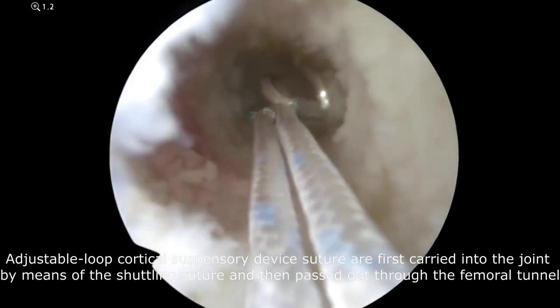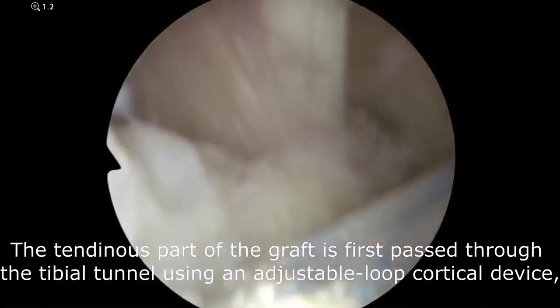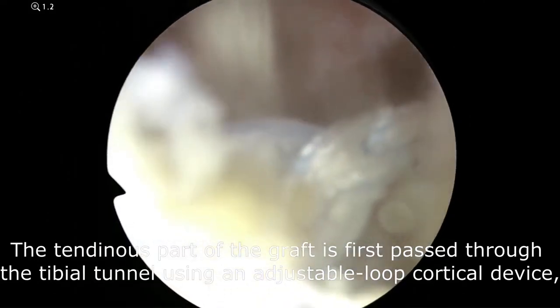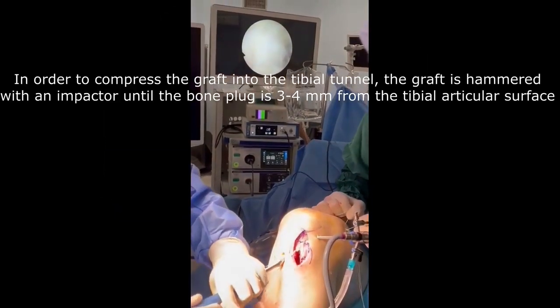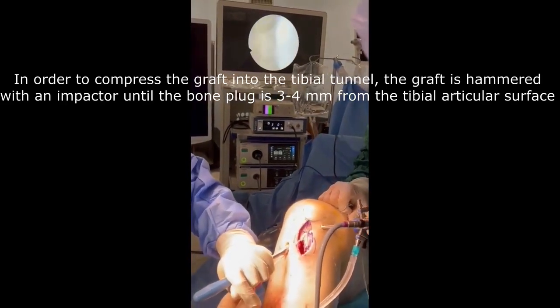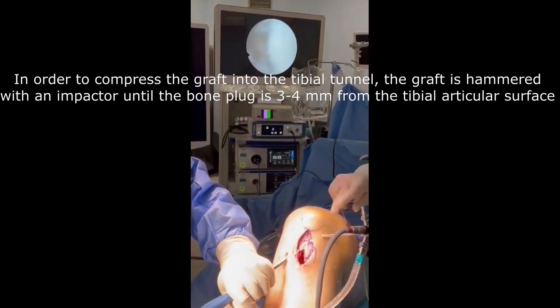The tendinous part of the graft is first passed through the tibial tunnel using an adjustable loop cortical device, then inserted into the femoral socket. In order to compress the graft into the tibial tunnel, the graft is hammered with an impactor until the bone plug is 3 to 4 mm from the tibial articular surface.